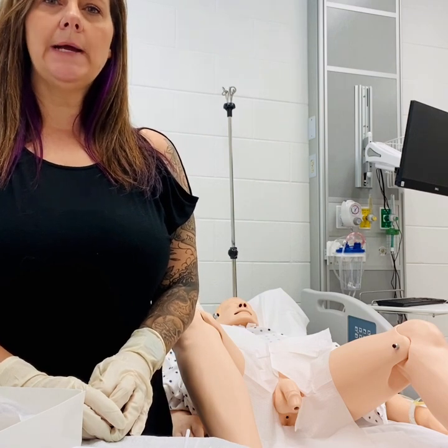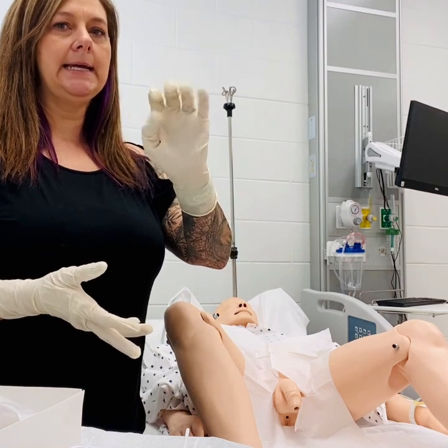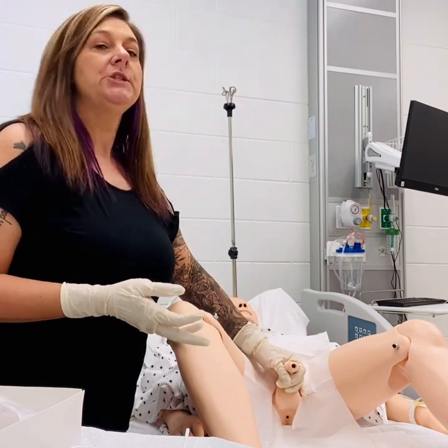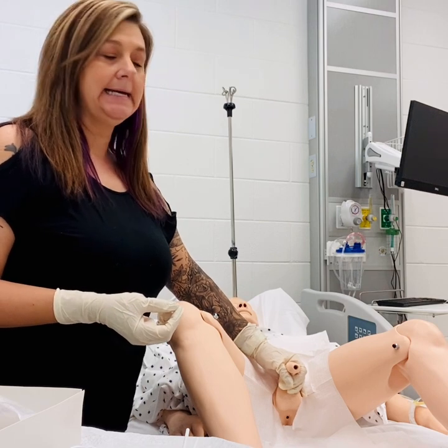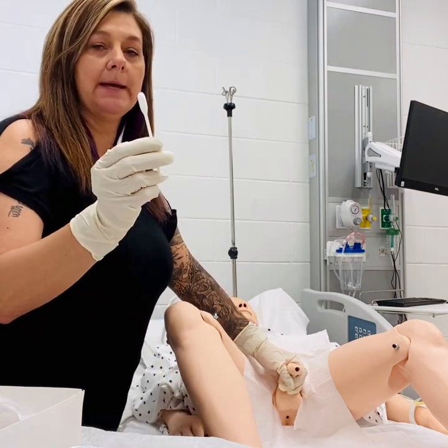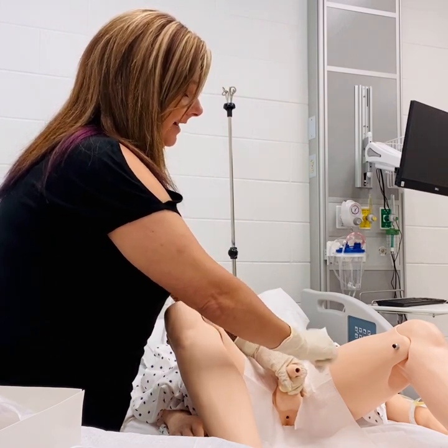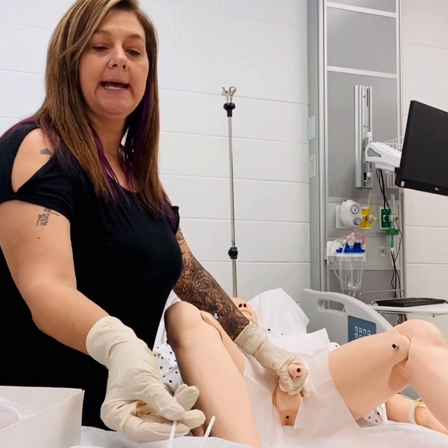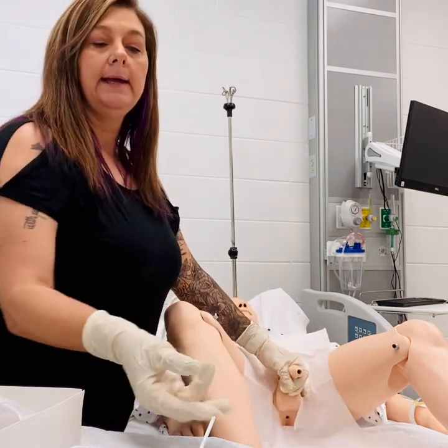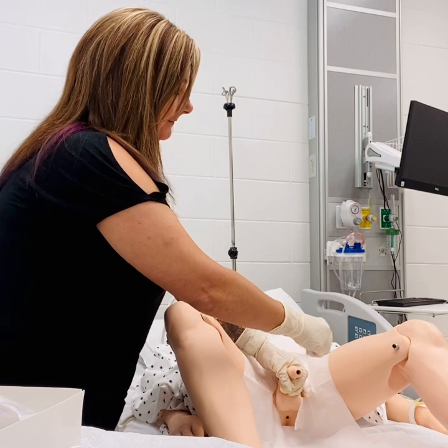To insert a Foley catheter on a male patient, all steps are the same until you reach the point of cleaning the area. For a male patient, you would want to use your dirty hand as with a female, and with this hand you're going to grasp and hold perpendicular at a 90-degree angle. If the patient is not circumcised, we would want to retract the foreskin so that the urinary opening is visible. This hand is still sterile, so we'll use our betadine swabs and clean in a circular motion starting from the inner center all the way around to the outer area of the head of the penis. Then we'll use our second swab and do that exact same thing, and our last swab one more time.